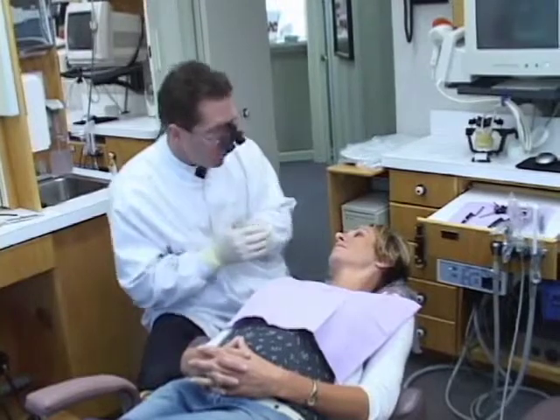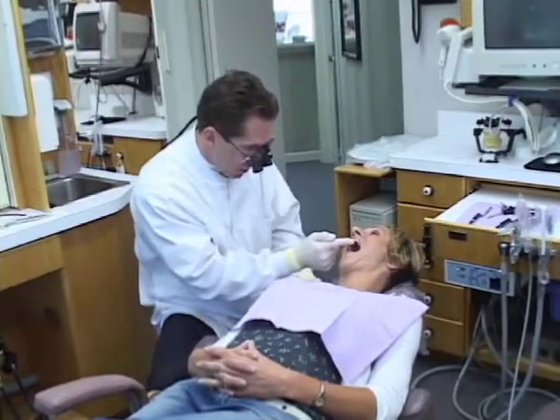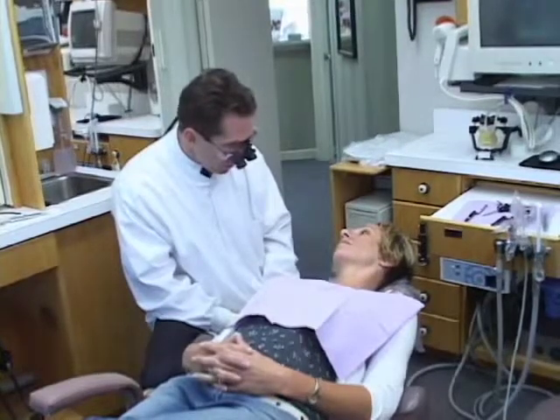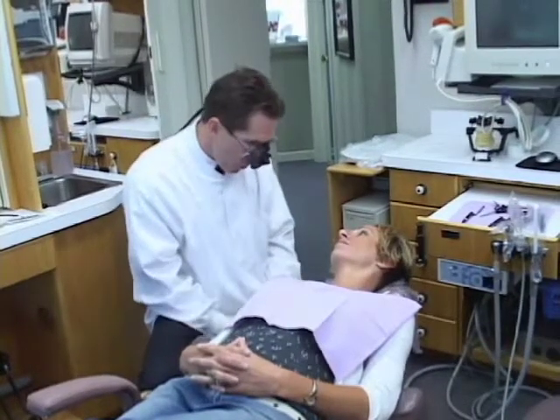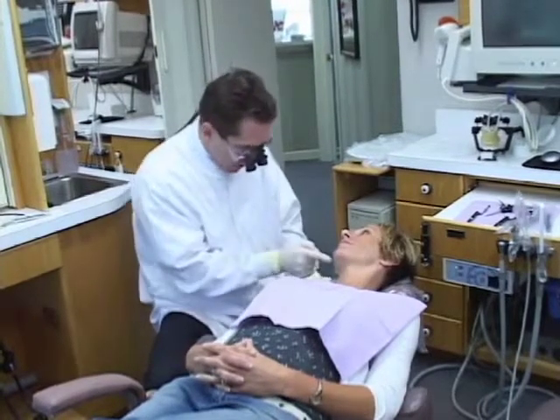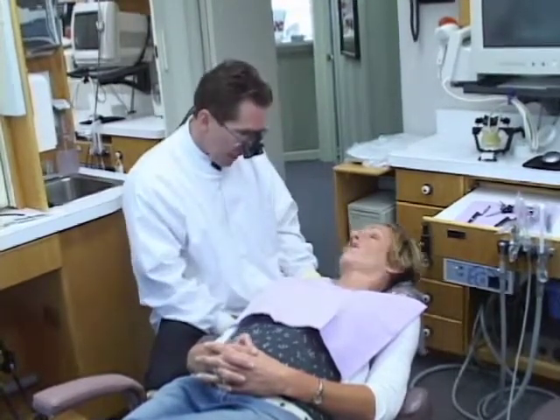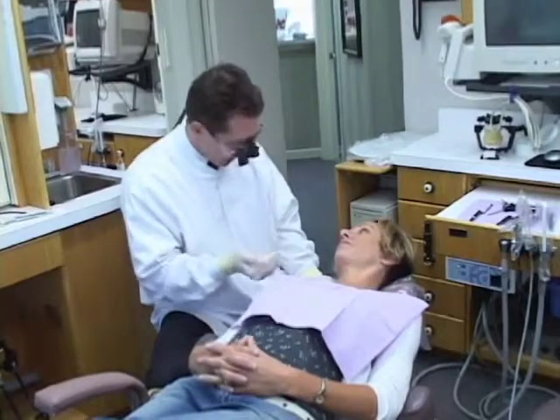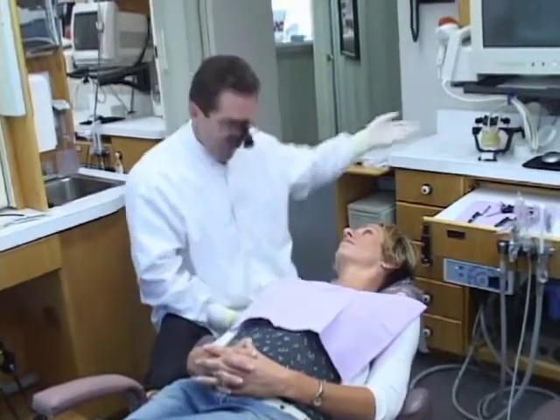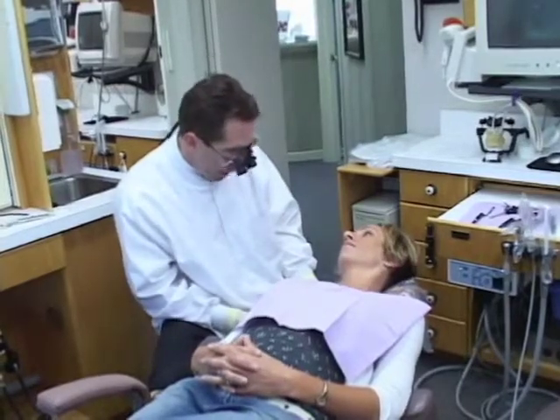At this point in time, what we're going to do — we're going to take that little island, that little island that you're touching on now. I'm going to reduce that down a little bit, down to the point where your first tooth touches. In your case, as we saw in the models and as you've experienced, it's probably going to be that last tooth in the back right-hand side. And that'll just lend further confirmation that everything we've done in this model is, in fact, the reality.